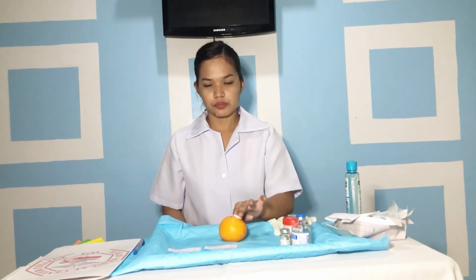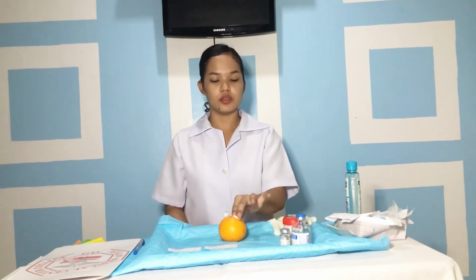So proper needle disposal prevents needle stick injuries. Then we apply gentle pressure. So do not massage the site, because massaging the area may spread the solution to the underlying subcutaneous tissue. And then we help the patient to a comfortable position. So this will reduce the patient's anxiety and discomfort.